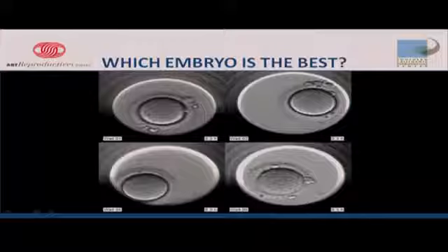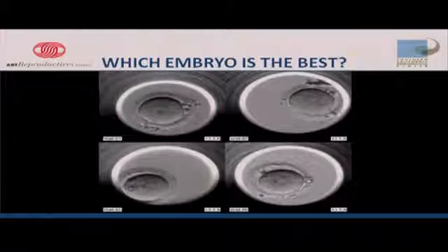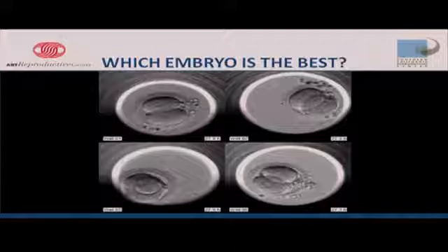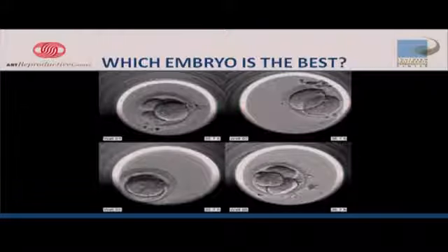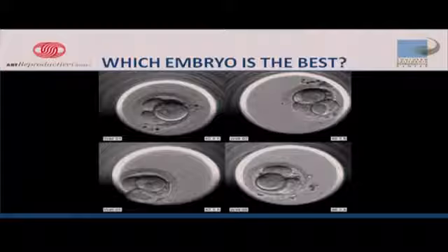So which embryo is the best? So going to play this one. There's 4 embryos. You look at them all, of which ones you want. So I've told you a couple little things. So go ahead, Kevin, play it. Try to pick which one we think would be the best, which one would be the transferred one. And if you look at them there, they all had 2 pronuclei. The ones on the upper left and the lower right divided to 2 cells faster than the other ones. We've gone along there. You actually see some multinucleation in the bottom right one when those 2 cells. The one on the upper left is fastest. It's 4 cells already. The other ones were a little bit behind that.